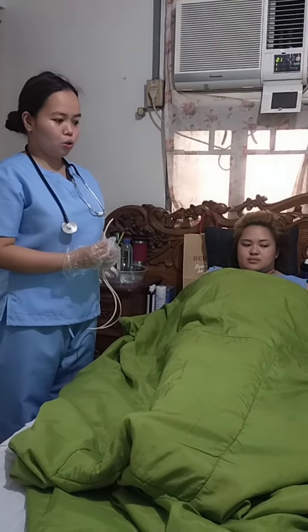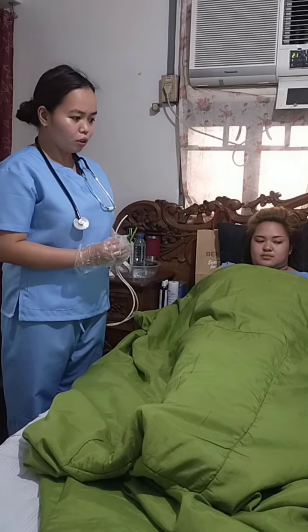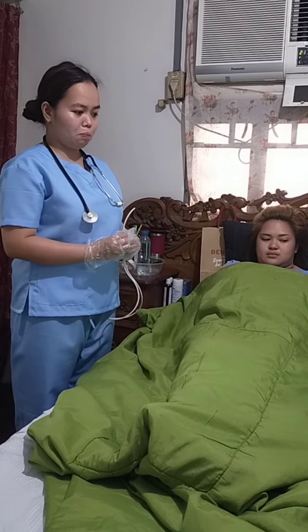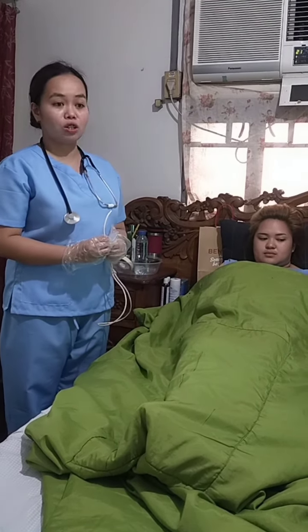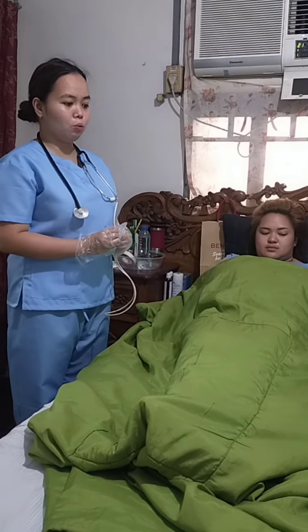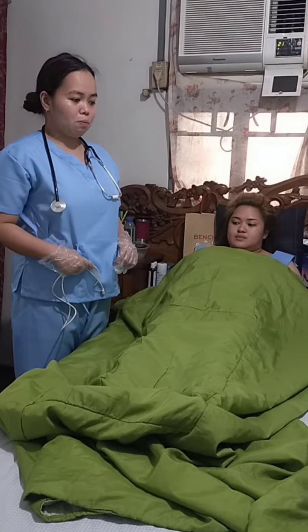Insert the tube into the nostril by directing the tube downward and backward. Then, when the tube reaches the pharynx, instruct the client to tuck the chin, and then encourage her to swallow, even if no fluids are permitted. Advance the tube when the client swallows, and stop when the client breathes.